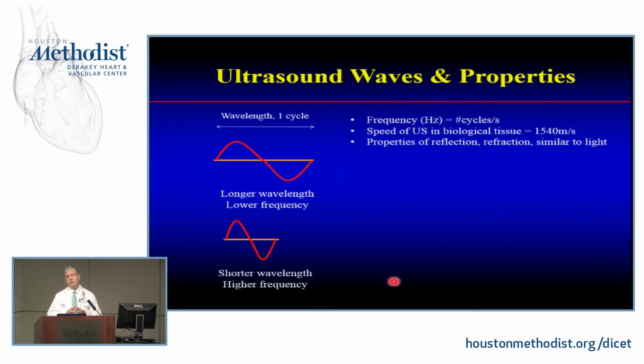You also need to know that the way you know depth when you put your ultrasound transducer is you solve for the velocity. So I send a little spurt of ultrasound. It goes and hits an organ and it comes back. And if I know the speed of ultrasound in biological tissue and how long it took for that burst to come back, then I know its depth. So whenever you look at an ultrasound and see depth in centimeters, basically it's solving for the equation of speed and how long it took for you to look at the image.